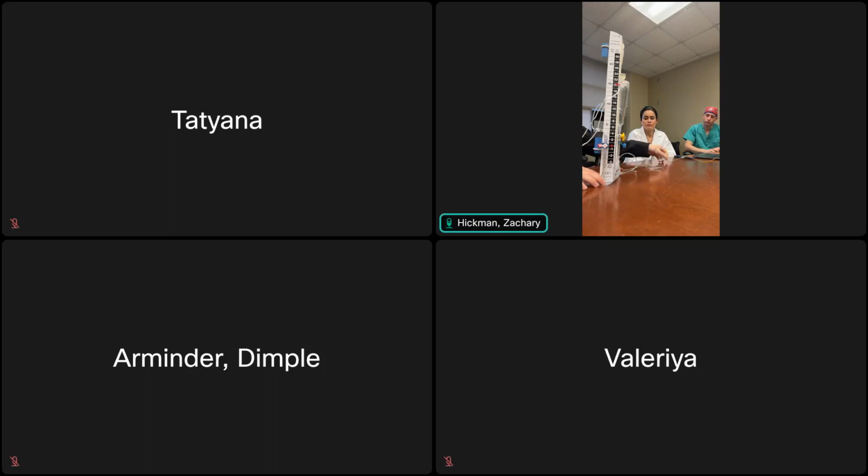So you're connected to the patient's head on this end. We turn this clamp so that it's away from the patient, so that you can't push any fluid down into the brain. Then you connect through your port here, and you can flush all of this distally. After I do that, I reopen to the patient, I drop again, and I see if that's fixed it. Hopefully it has. If it hasn't, then probably your occlusion is proximal.